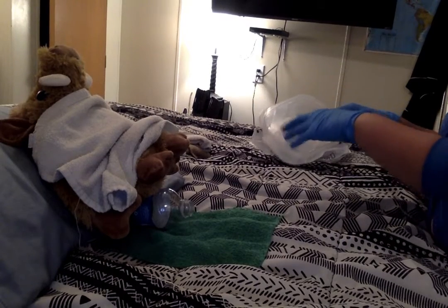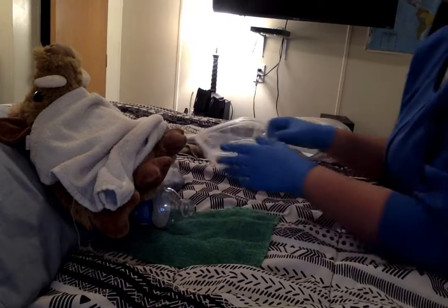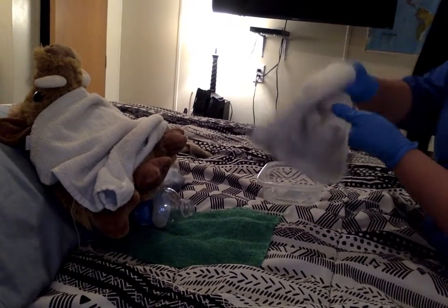We're going to grab our water. We're going to make sure that it is the right temperature. We're going to ask her if this is okay. Miss Lynn, is that okay? She says yes, that's a good temperature. So now we're going to perform our peri-care on our patient.